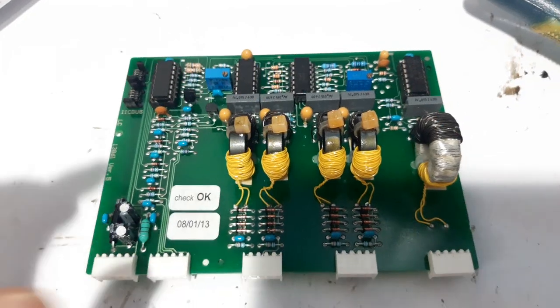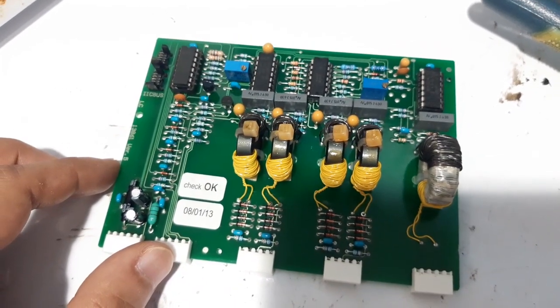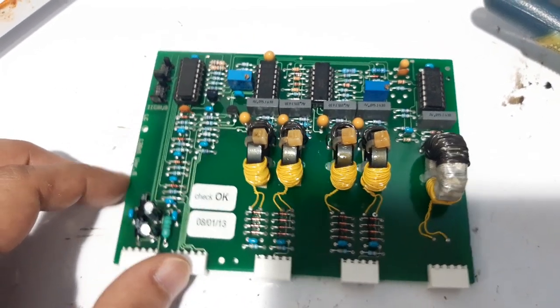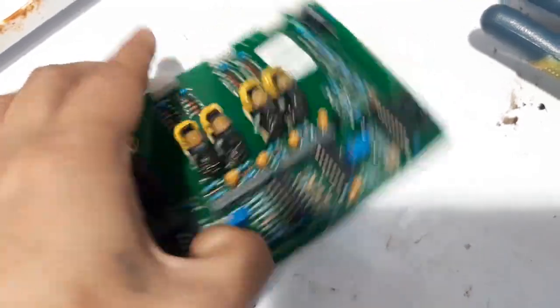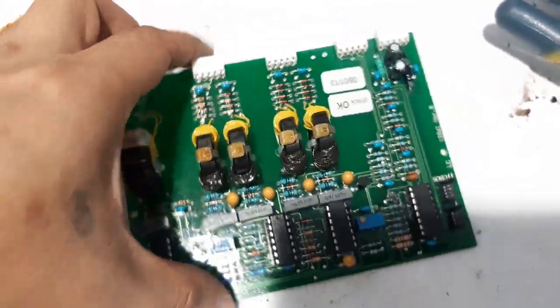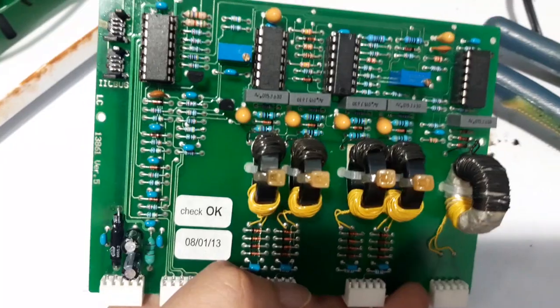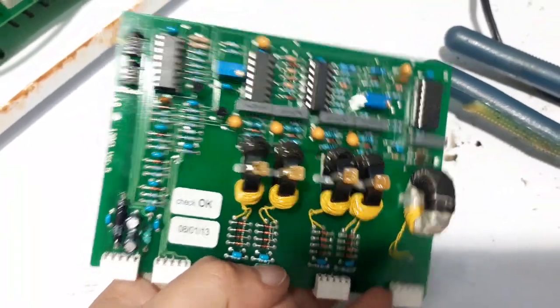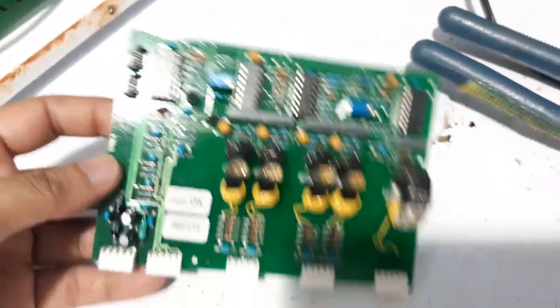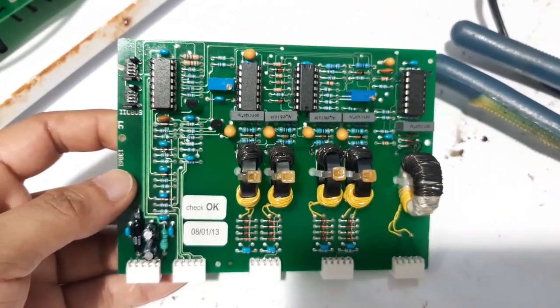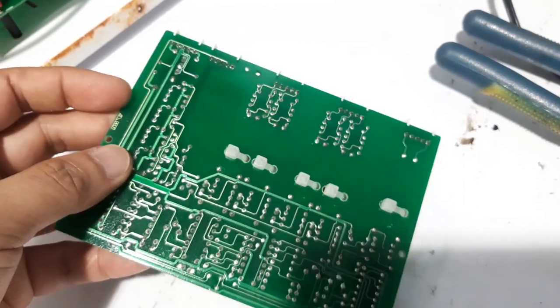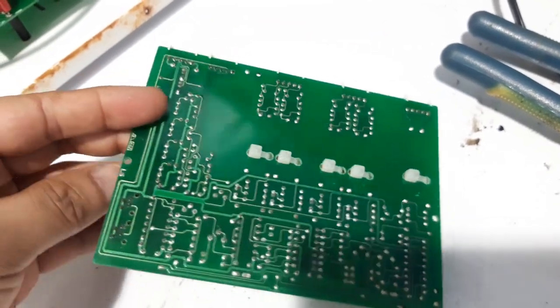This is the board. Now this board is very expensive and we need to order it from Germany, so we will try to repair this one to save time and money and we can run the machine immediately.